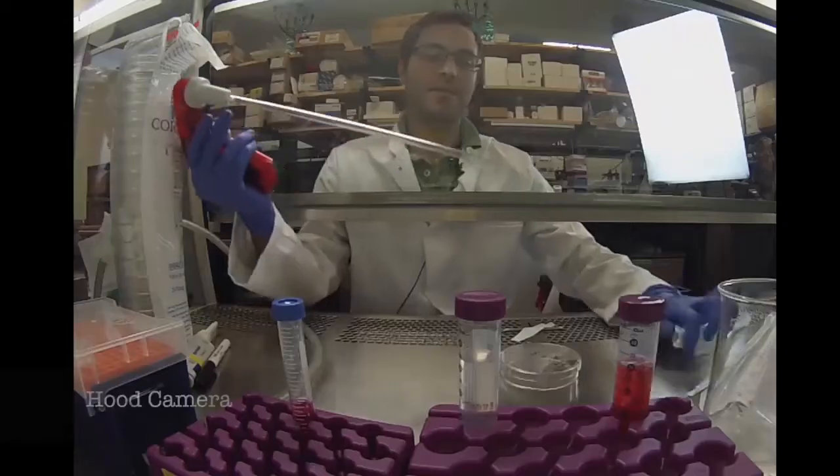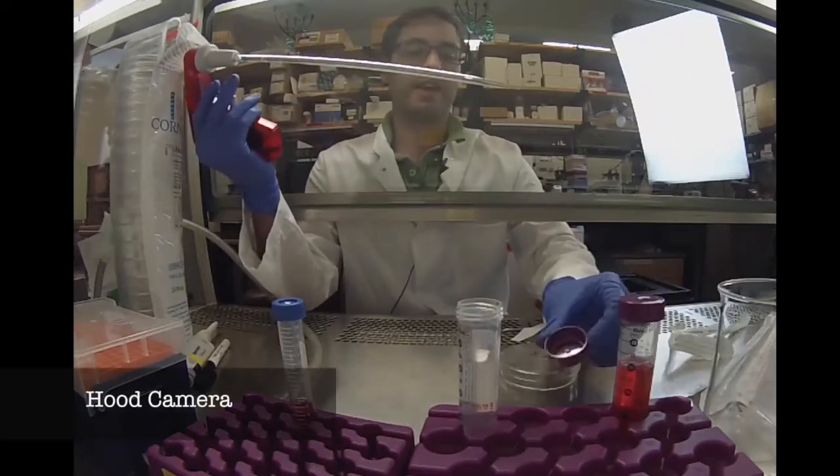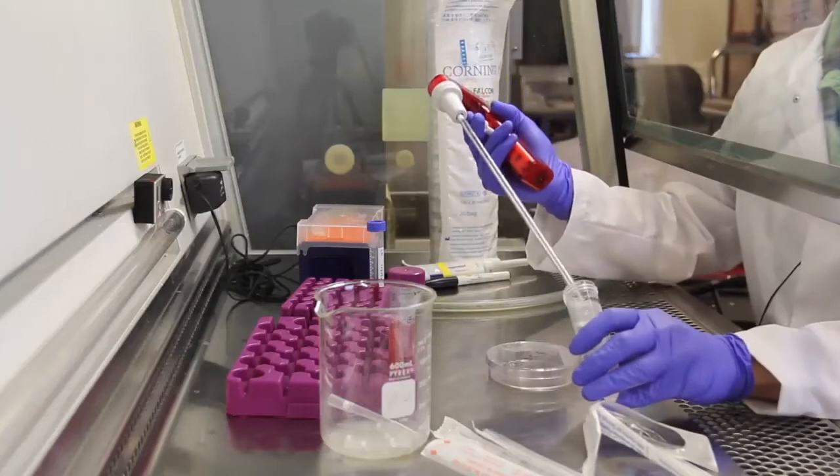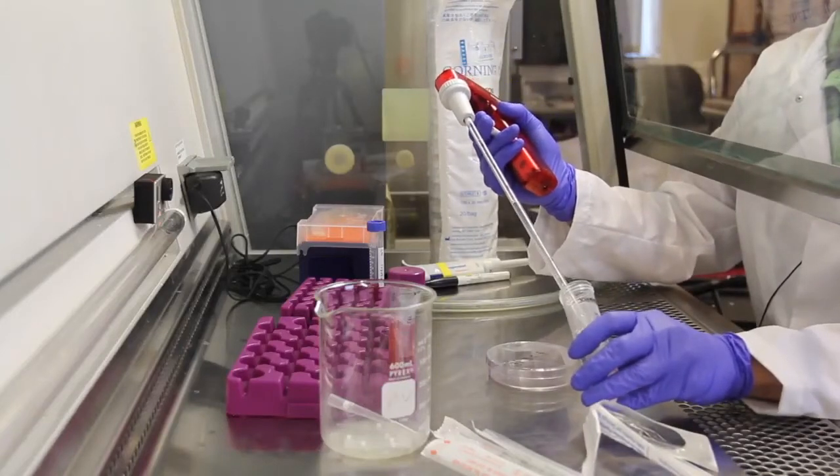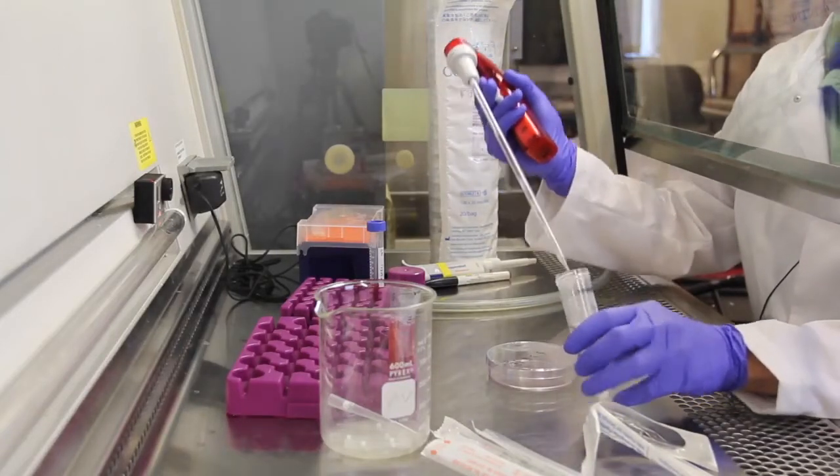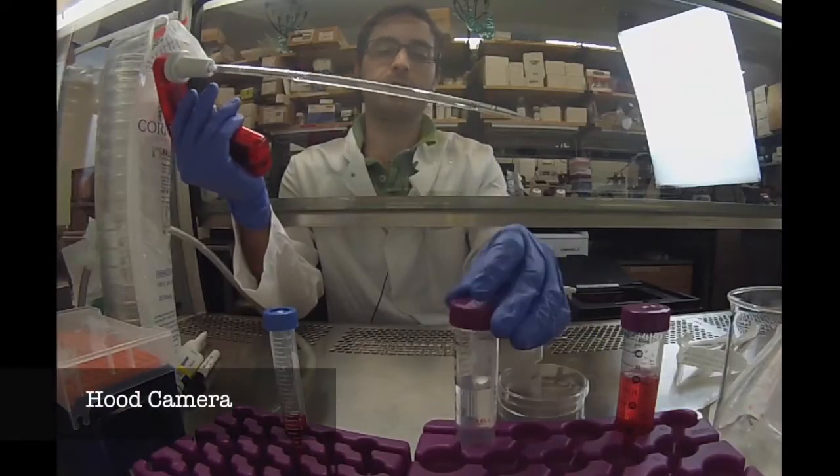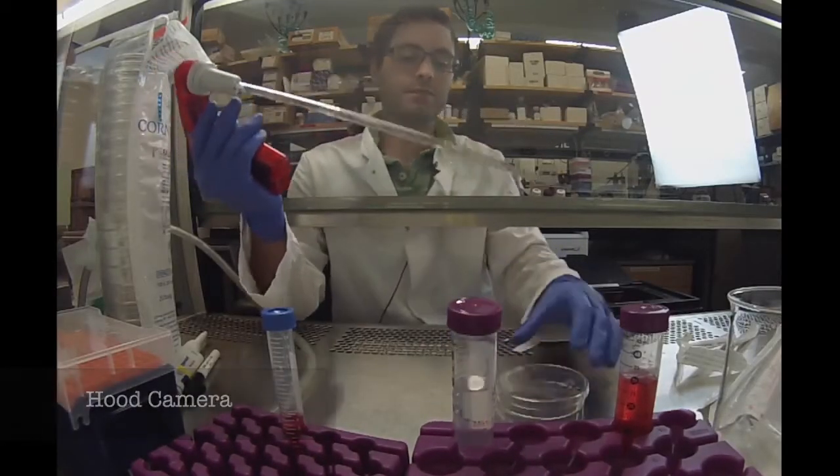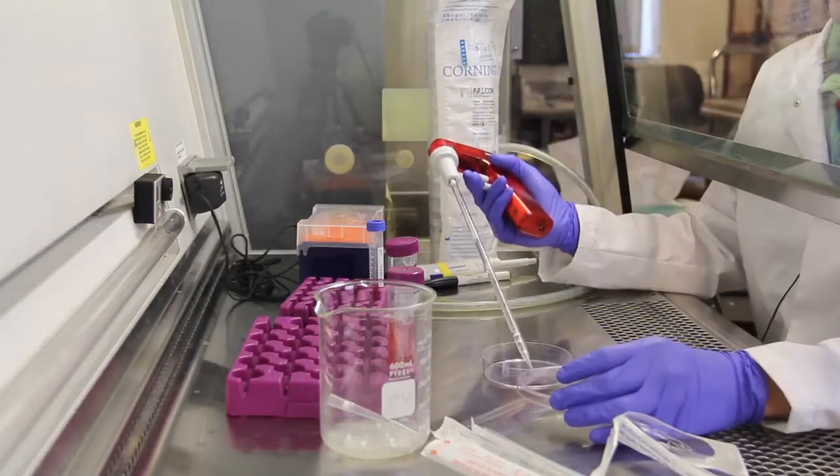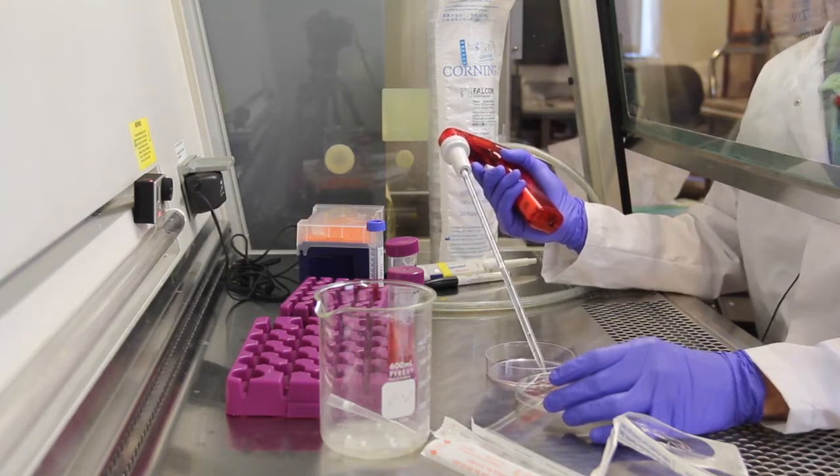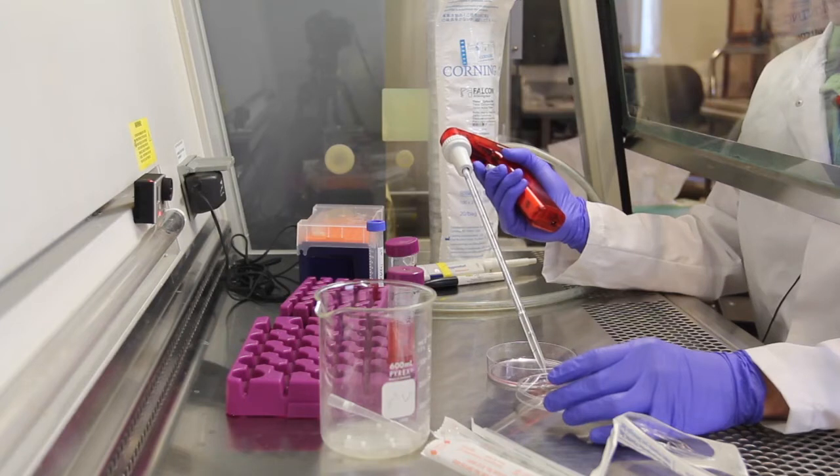I take this five milliliter pipette, open the cap completely, flip it upside down to prevent contamination, take the tube, take five milliliters of PBS, immediately reseal the tube to prevent contamination and carefully pipette it into the plate. I pipette down slowly to prevent any cells from lifting off the bottom of the plate.